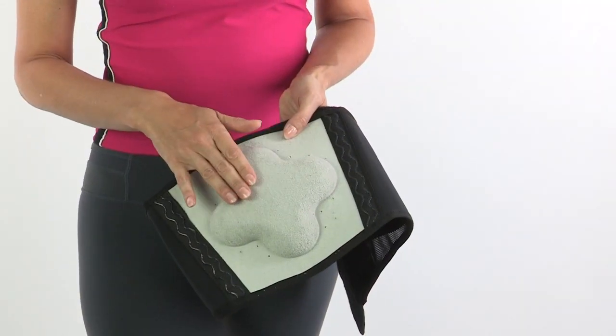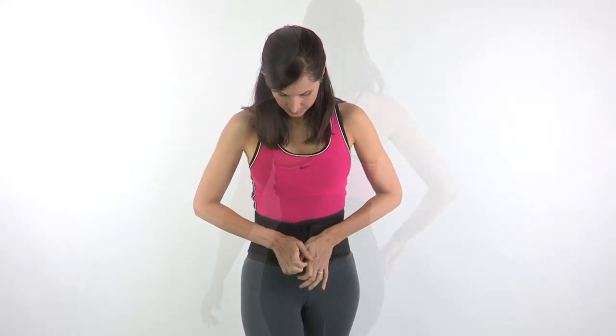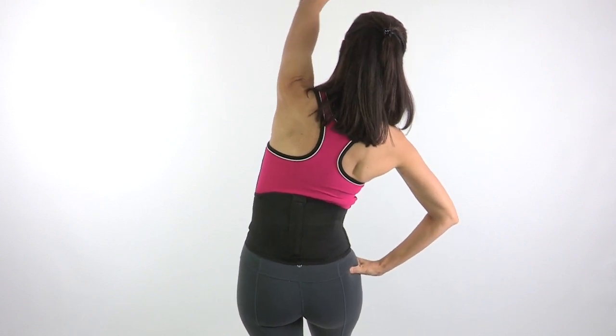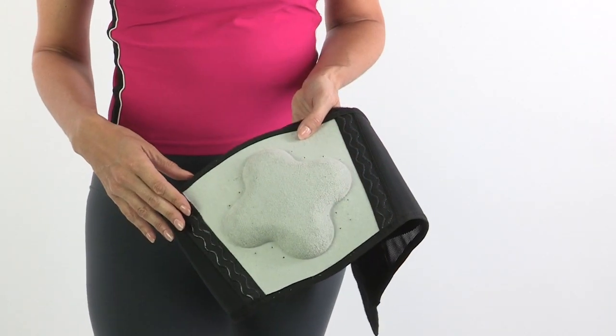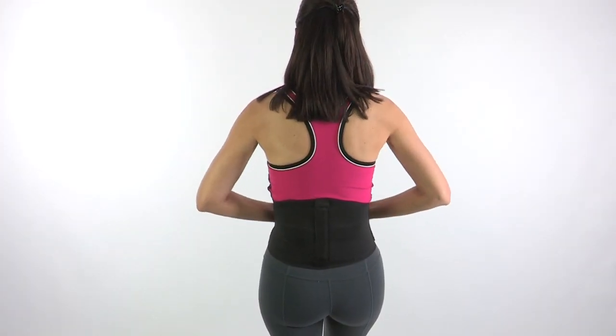The molded lumbar compression pad delivers comfort and, together with the overlapping double pull straps, provides extra support to the low back and abdominal area. The silicone gripper strips on either side of the back pad keep it in place. It's durable and latex-free.